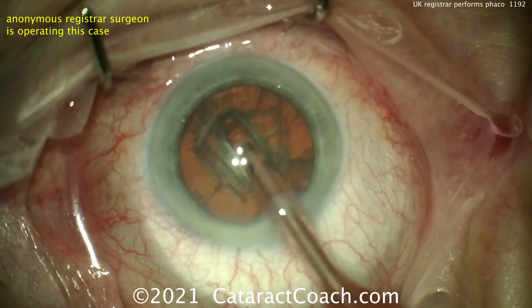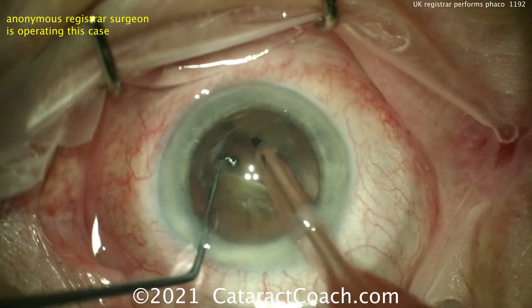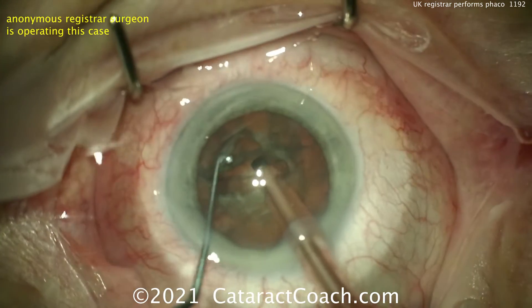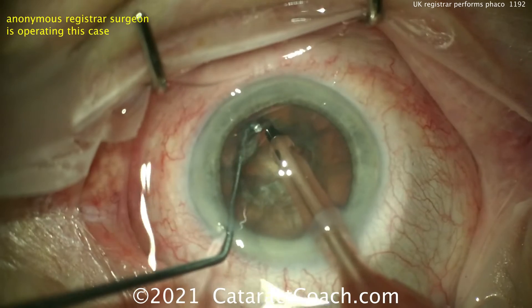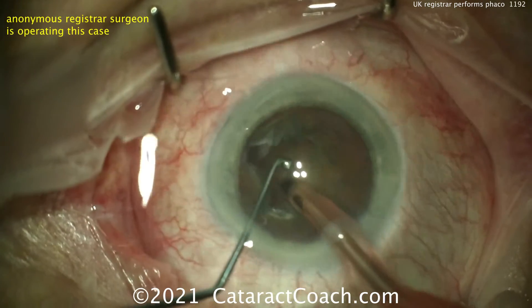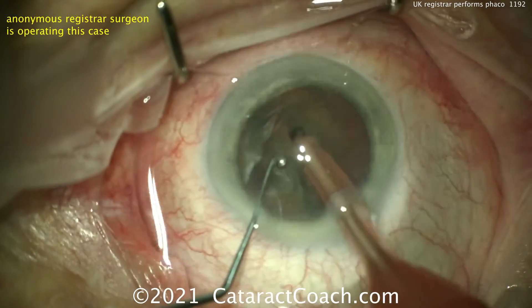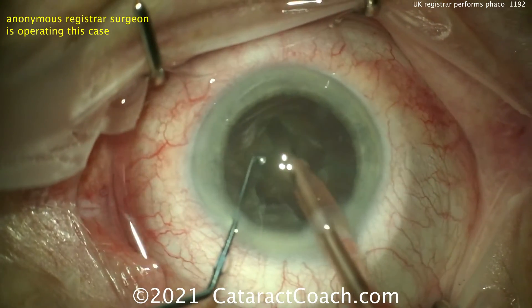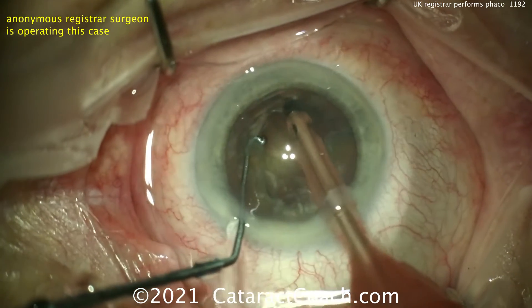That's a nice technique — you can go there under the rhexis as well to help propagate this crack. Now putting in some sort of second instrument here, like a ball-tipped instrument, and splitting the nucleus. That's a good split, good positioning. A divide-and-conquer technique. Rotating it here now 90 degrees and doing the other part of the groove. Divide-and-conquer is a great technique — it certainly works, and it's something most residents and registrars in the UK start off by doing. So all four quadrants are going to be made and split prior to removing anything. May need a little bit more energy. You just need enough of a groove to place the two instruments — the chopper or ball-tip instrument and the phaco tip — inside and get a good split.